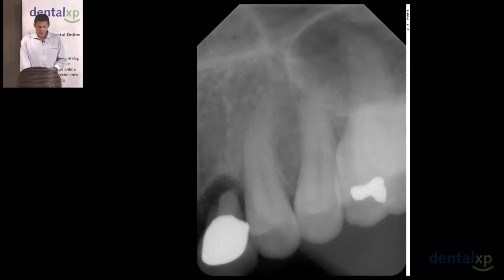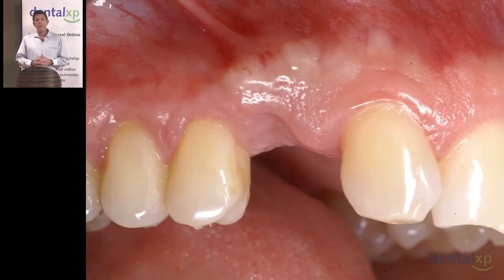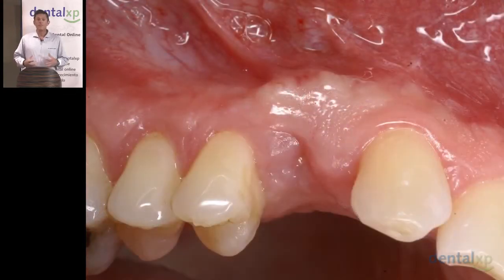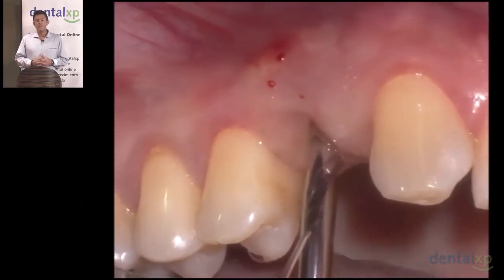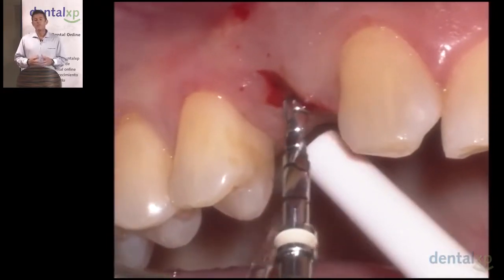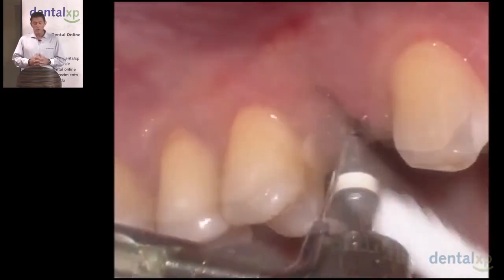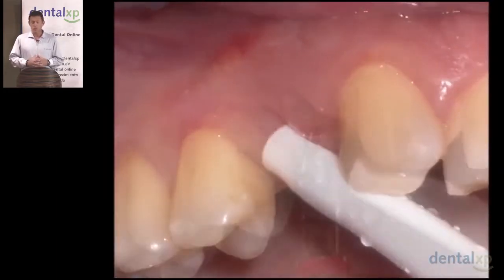In today's video we're going to be going over the treatment of a failing deciduous or over-retained deciduous canine. After many years of function, the tooth was removed and the soft tissue was allowed to heal in the area of the maxillary right canine. What we're going to attempt to do, using cone beam CT technology, understanding that we have most of the defect filled with bone, is place the implant within the confines of the remaining ridge.